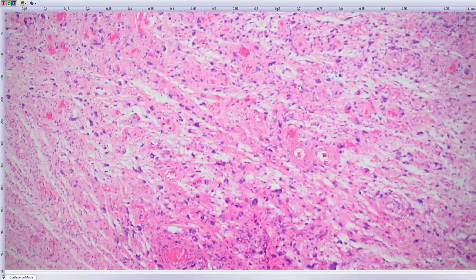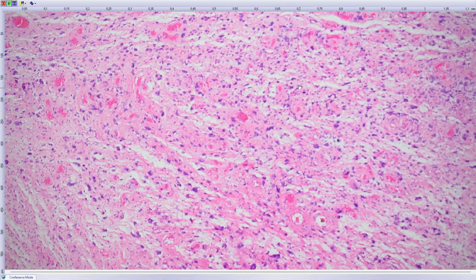Yeah? These were published in the past as malignization of angiofibroma of vulva. I have a different suggestion. The spindle cell part is a fat-free lipoma-like lesion, and what you see here is fat-free pleomorphic lipoma. That means it's a perfectly benign lesion. We have several cases of this which behave so far in a benign way.